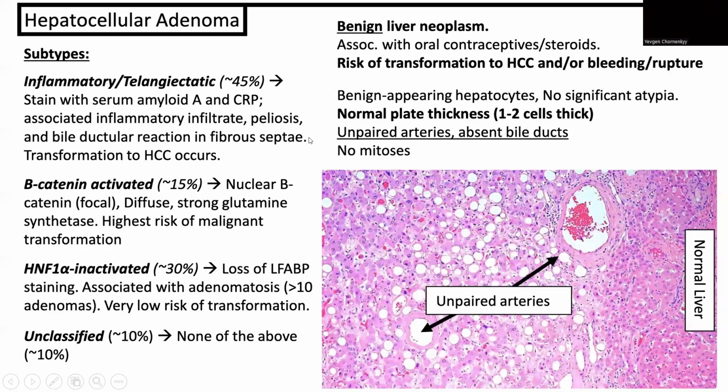Okay, and then, so again, these are all from Kurt's notes. Kurt's notes, shout out to Kurt's notes. I passed my boards because of Kurt's notes.